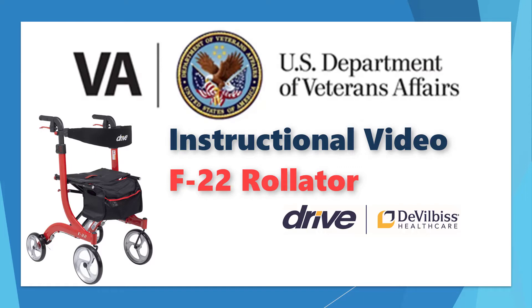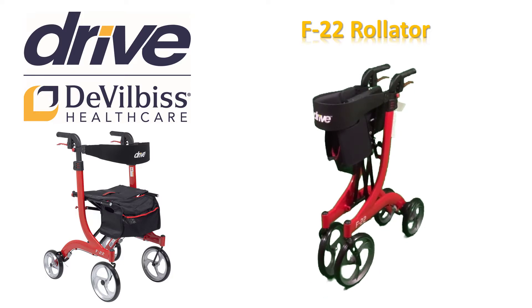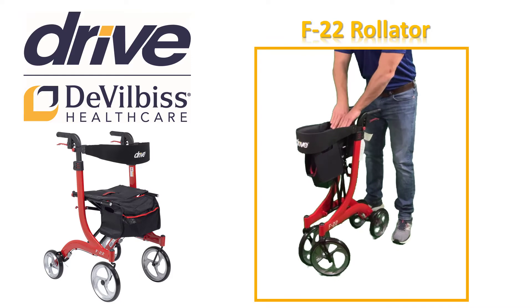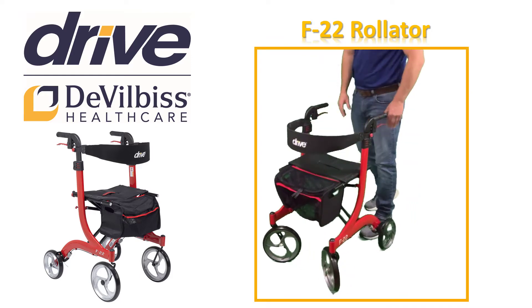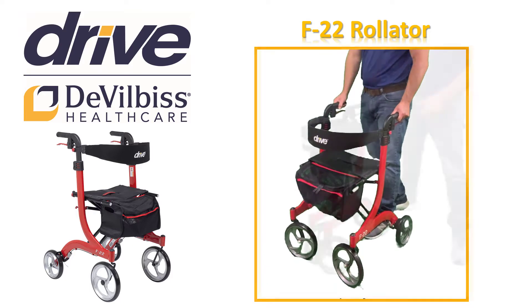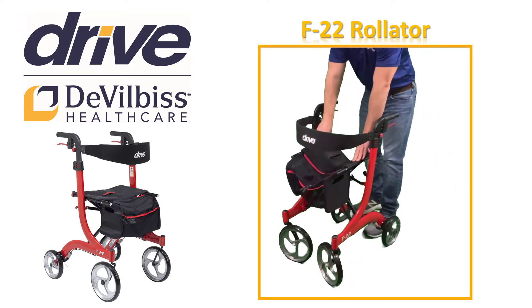Let's get started with a short instructional video to help get you going. Your new F22 Rollator will stand on its own when collapsed with its unique side-to-side folding. This will save you space in your home or in a waiting room when you are not using the Rollator. To open the F22, simply push the handles out from each other until the seat becomes flat. Always be sure to lock your Rollator open by pushing down on the seat until you hear an audible click.